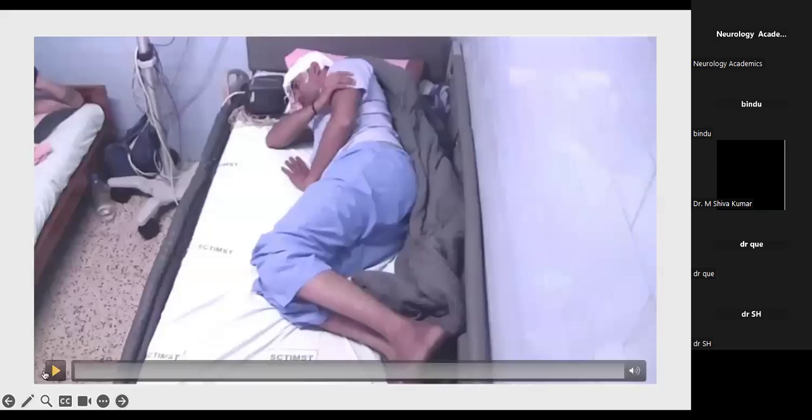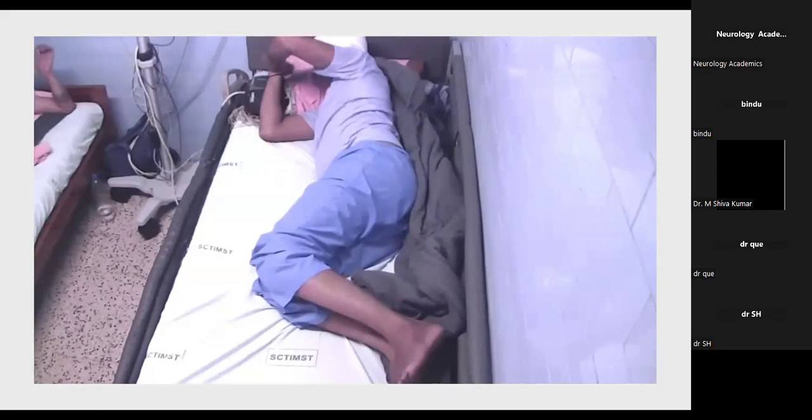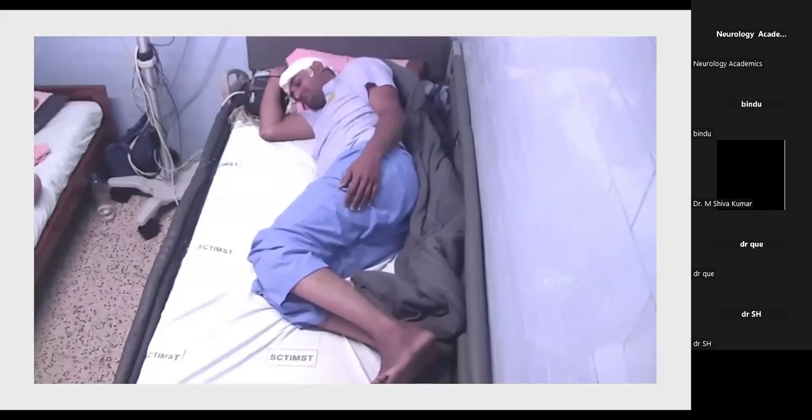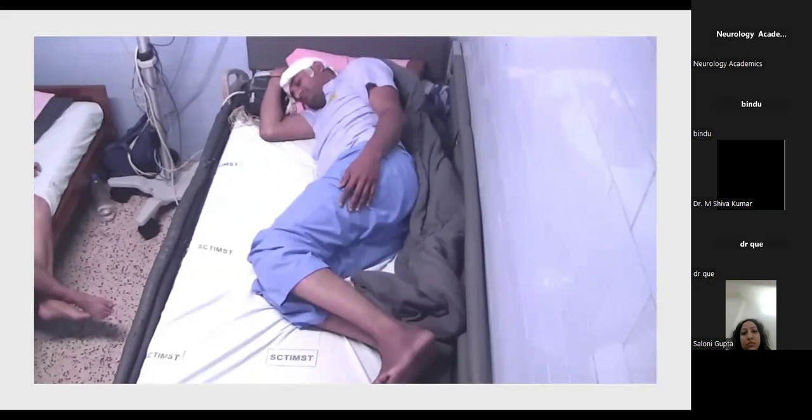Here I will be showing semiology of a temporal lobe epilepsy patient. Patient was initially lying down. Then he felt some aura. In this case, it was an epigastric rising sensation. Then he himself pressed the buzzer, and he was holding the buzzer, and he continued to lie down, closing his eyes.